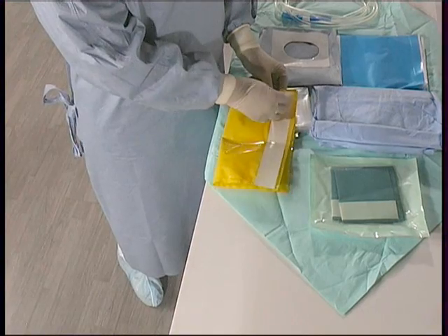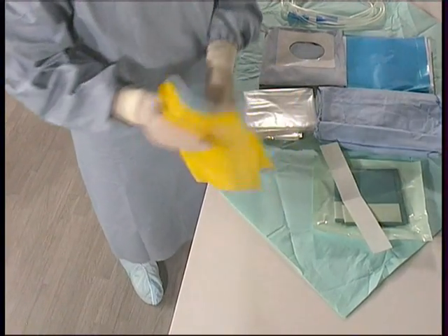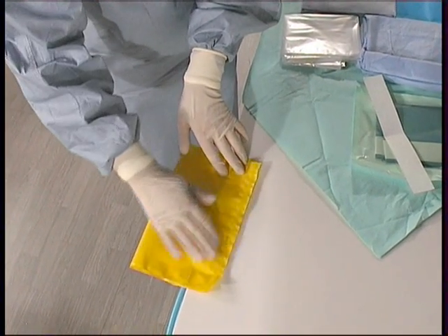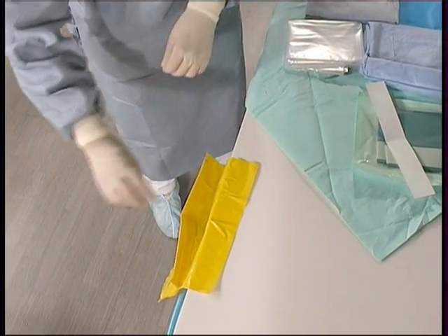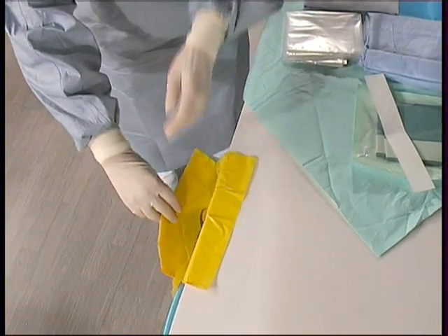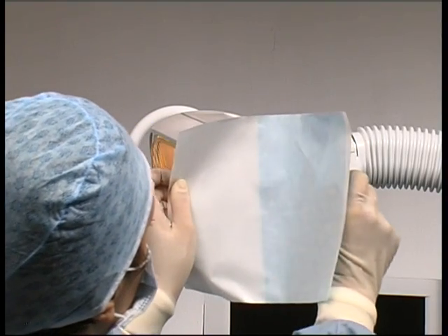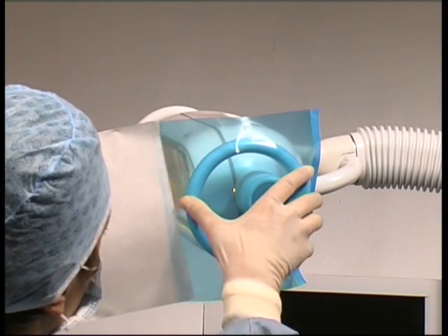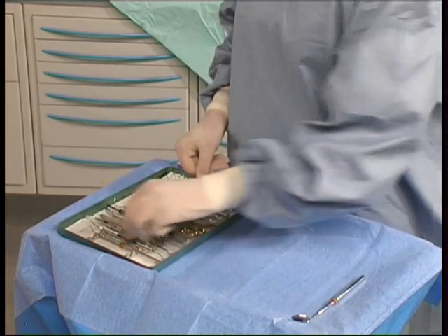The special safety pouch, which can be attached to the work surfaces, avoids the dispersion of contaminating materials around the operating room. The lamp handles are isolated using special adhesive covers. And finally, the instruments needed for the operation are laid out.